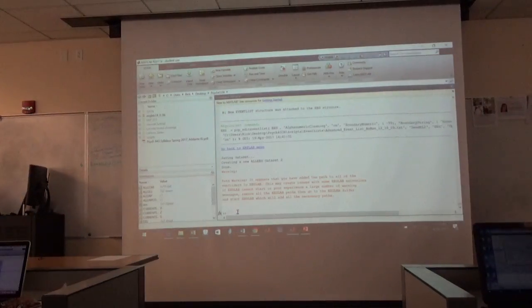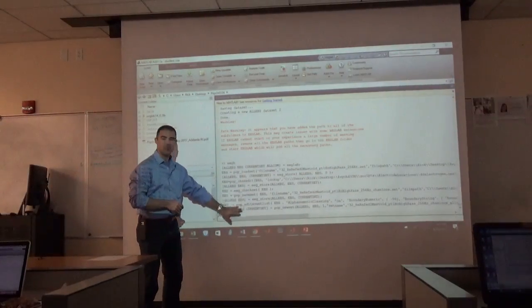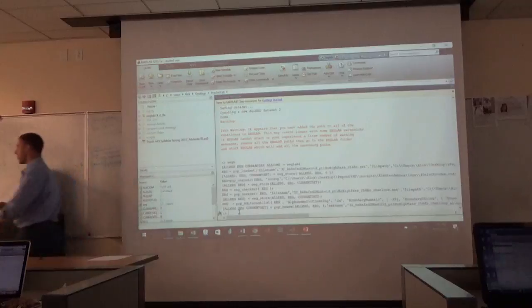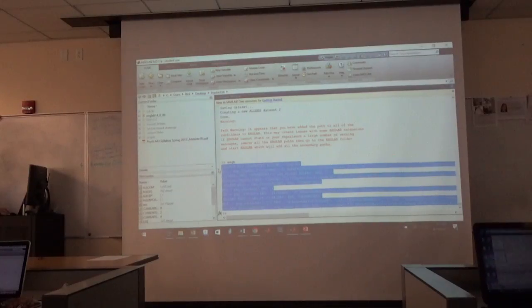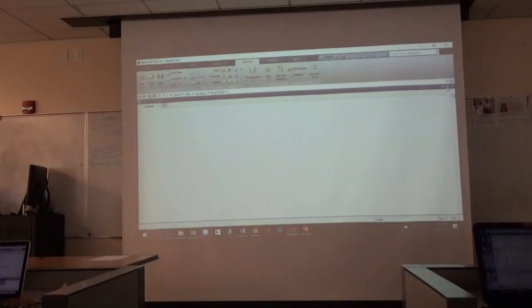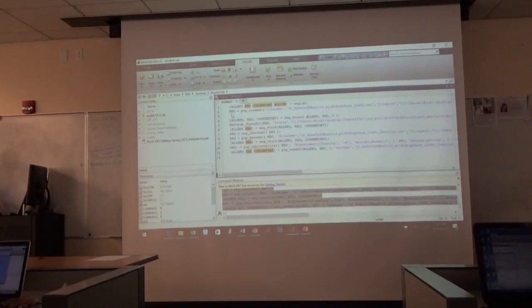So what you can do is, when I come into my command window and type in EEG with the letter H for history, it brings up all this gobbledygook. Now I'm going to decode this for you and tell you what it means. To show you what it is, I'm going to highlight it, copy it, and then open up a new script here on the top left. It's basically an open little editor. You want us to do it with you? No, you don't have to do it.